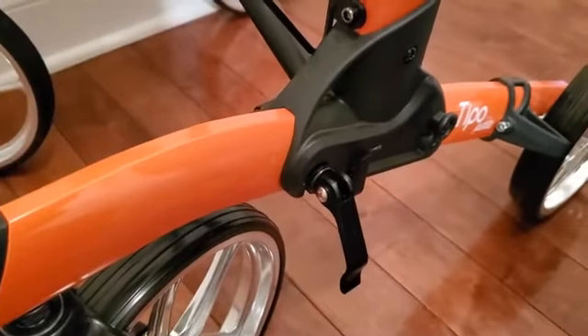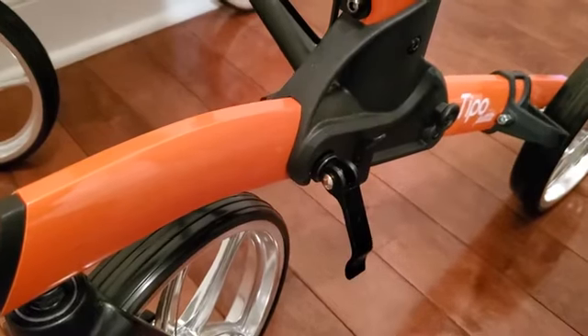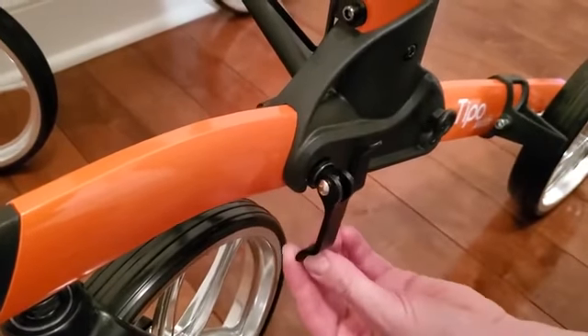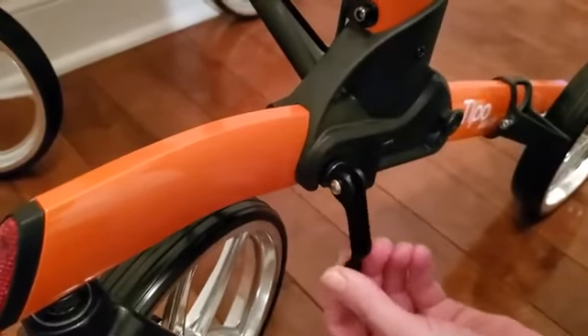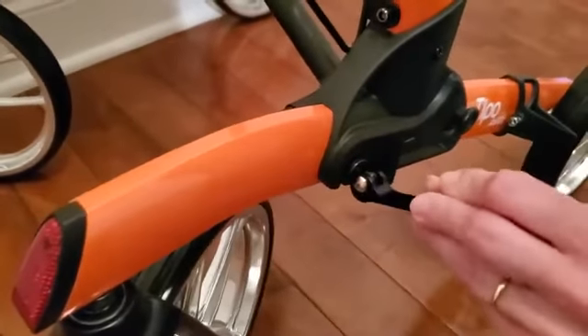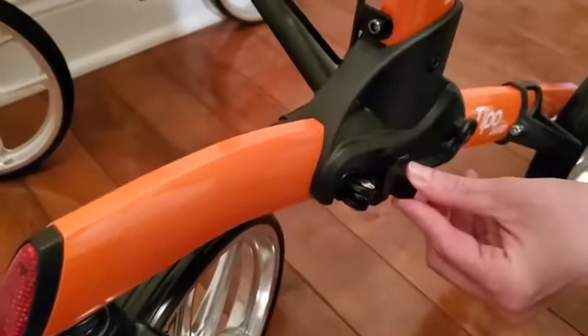If you're having issues locking the handlebars of your walker, chances are your lever is in the wrong position. If you try to lock the handlebars like this, it simply doesn't lock. You need to make sure that your lever is positioned correctly — this is the correct position, and you'll notice it slides right in. If it's positioned incorrectly, it will not easily slide in.